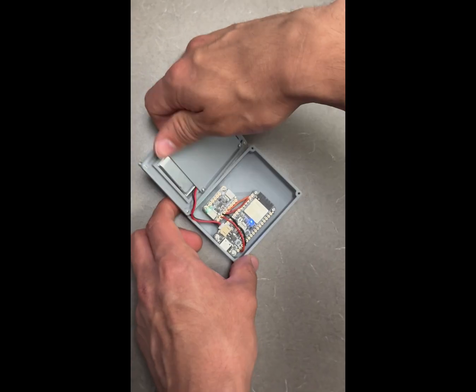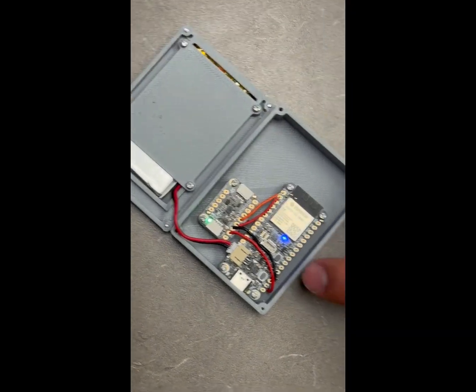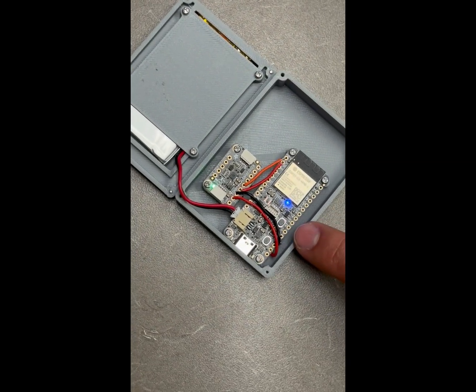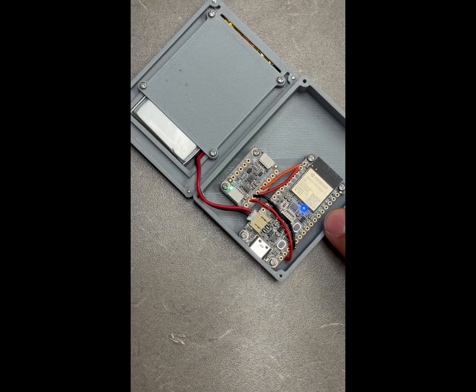If we open it up, you'll see three main components. Our first one being the battery. This powers the whole device. The battery is connected to our ESP32. This is the brains of the system and does all the calculations. It also has Bluetooth built in, so it communicates with our mobile Android device.